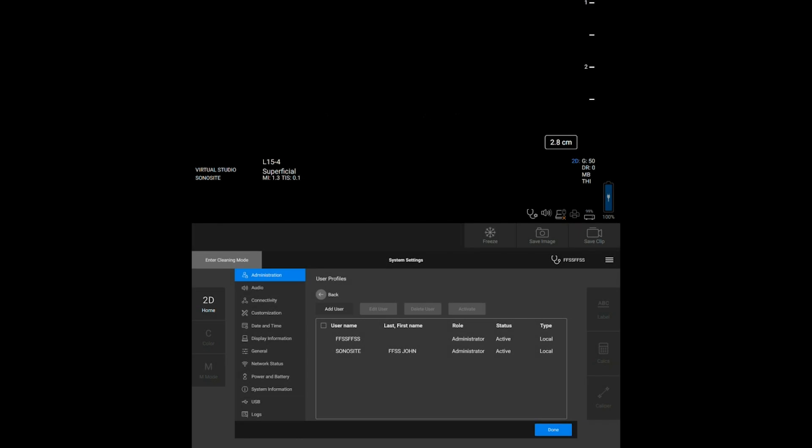Now that you've created a user, you can see them in the user list. You can manage user accounts by editing, deleting, and activating profiles.